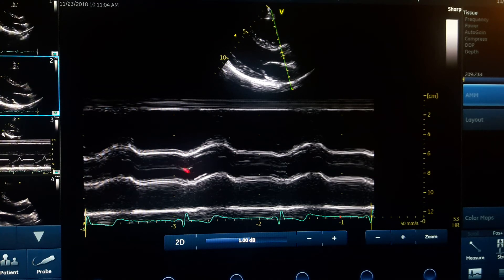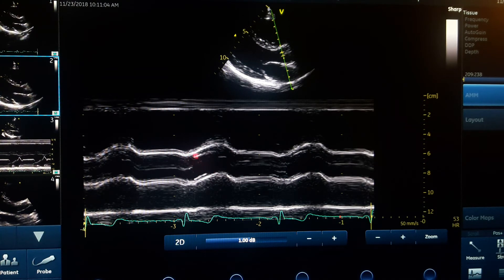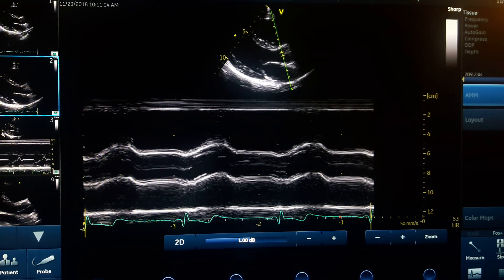With systole starting, the aortic valve opens: the right coronary cusp contacts the anterior wall of the aorta, and the posterior or non-coronary cusp — or sometimes left coronary cusp depending on your angle — contacts the posterior wall. The aortic cusp separation (ACS) is measured from one cusp to the other. The aortic root is measured right before opening of the aortic cusps. After end of systole, the cusps start closing and meet each other, and the cycle repeats.